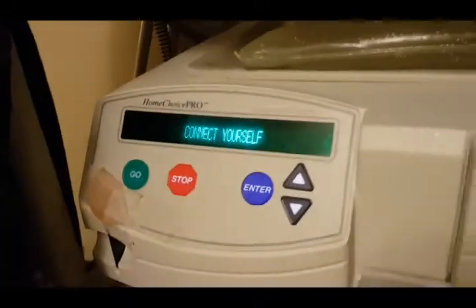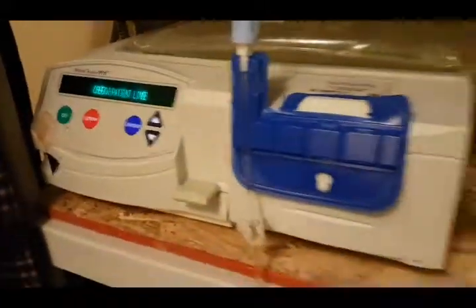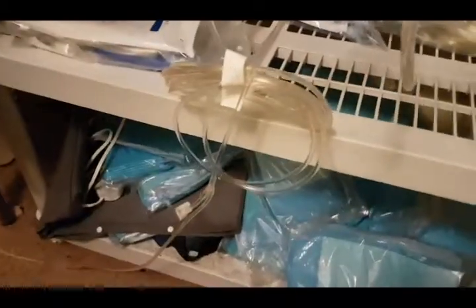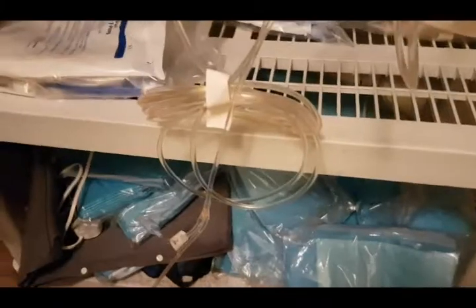If you look at the machine down below it, they're hanging down the hose. Go ahead and get a picture of the coil there. That's about 14 to 16 feet of hose. Once I hook up, I can go down the hallway almost all the way to the end. Bathroom, whatever, other bedroom. Looks pretty good.